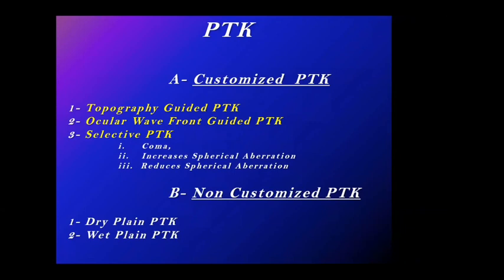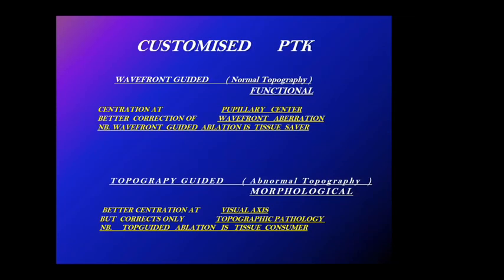Then you have non-customized, which is a plain PTK, and this is also divided into dry plain PTK and wet plain PTK. Even the wet is divided into thick wet and thin wet. We'll discuss all that soon. Now, the customized PTK, we said wavefront and topography guided.